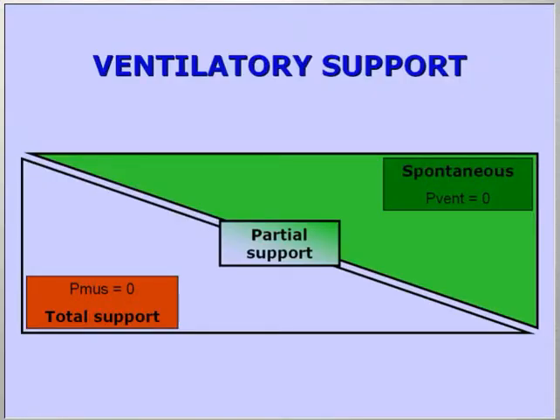A schematic way to see mechanical ventilation opposed to spontaneous breathing is to say this is the extreme where the ventilator is doing nothing and all the work is done by the patient, and this is the other extreme of total support where there is no muscular activity and only the ventilator's work of breathing. And in between, these are the modes of partial ventilatory support.